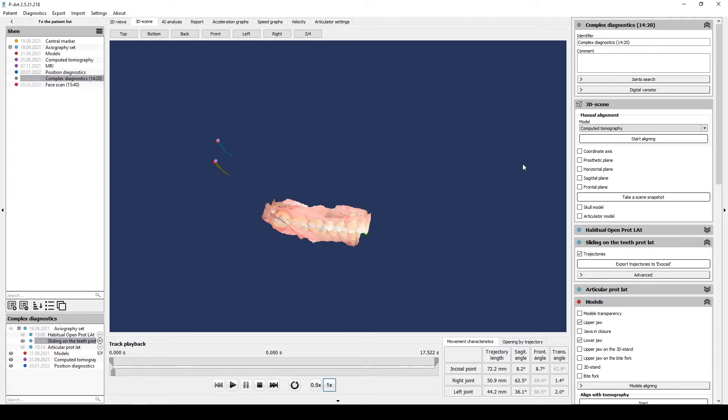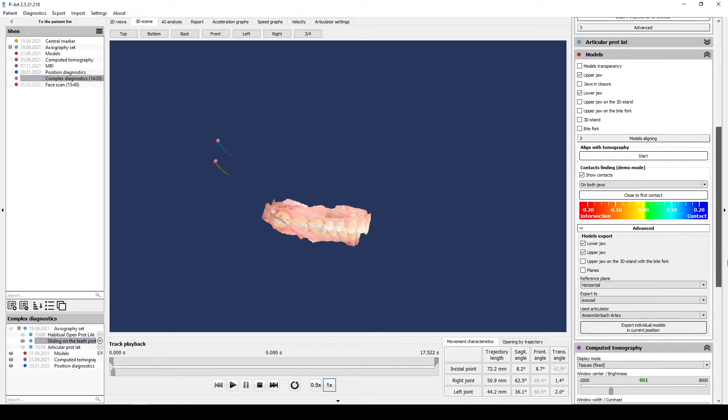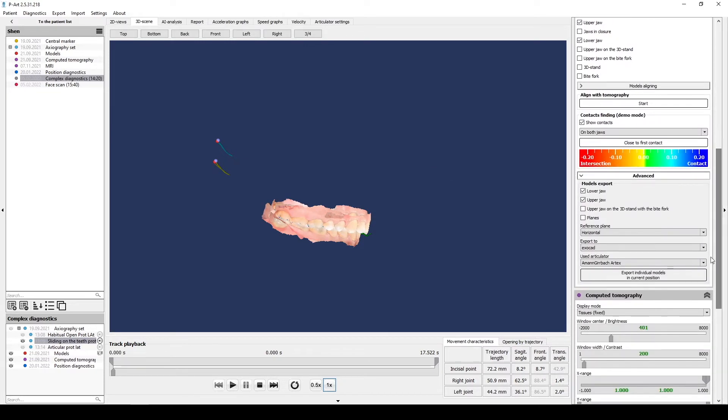Note that if you want to export Axio trajectory to ExoCAD, in the Export individual models menu you need to select upper jaw on the 3D stand with the bite fork.